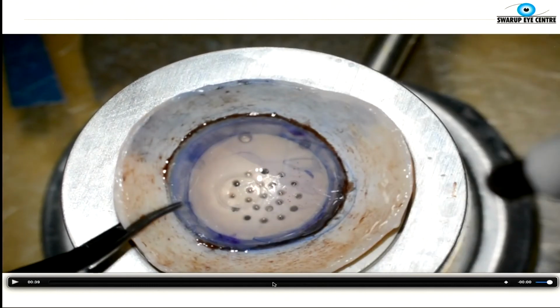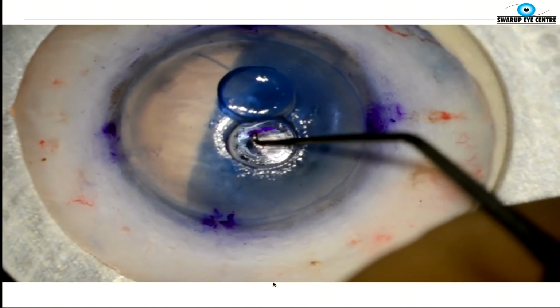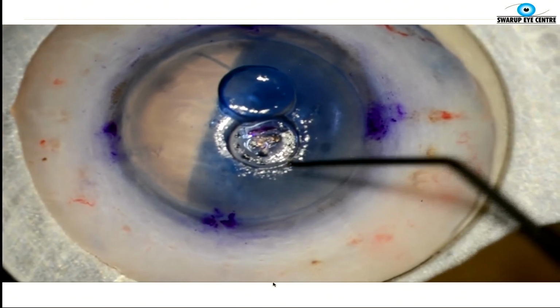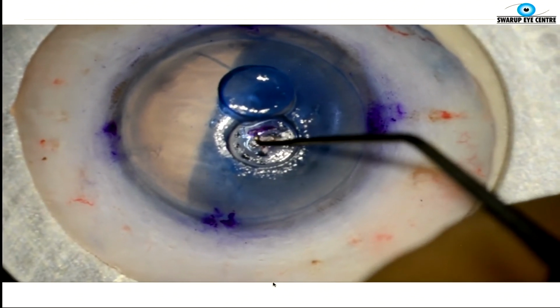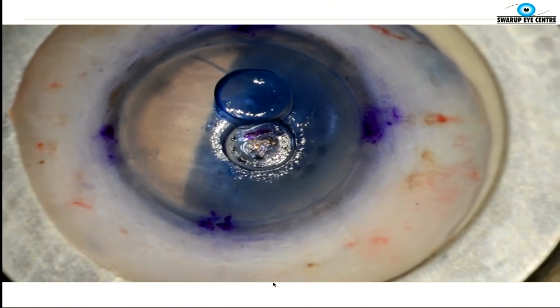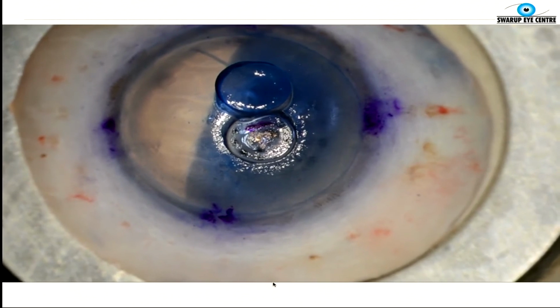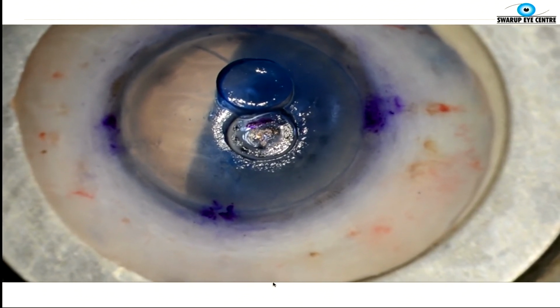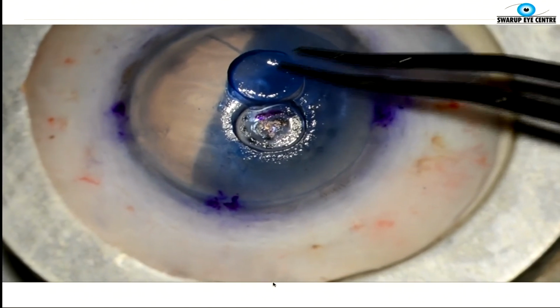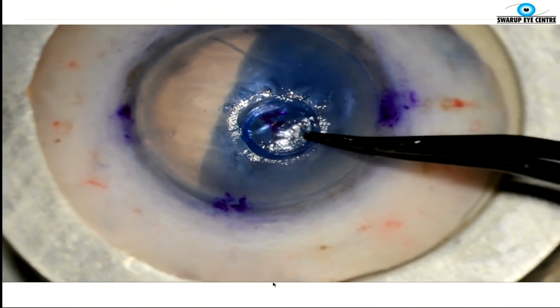And that basically helps you to get a window to mark the anterior surface like so. So now the graft corneal button has been inverted, and that punched button has been lifted up, and you can put any asymmetric mark. You have ready-made stamps, or you can just stain a Sinskey hook with gentian violet and put the mark. So it's important to put an asymmetric mark like F, S, or a P, so that you can check the orientation when it's inside the eye. Don't put an O.